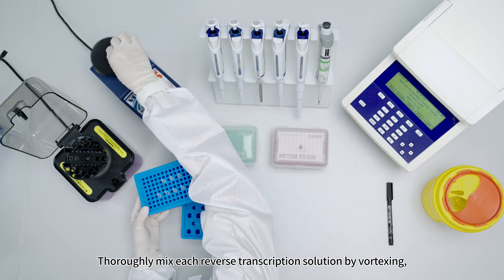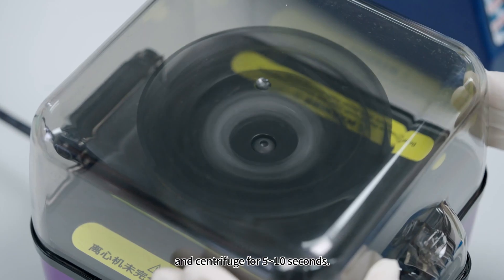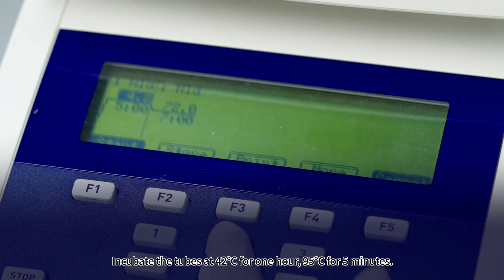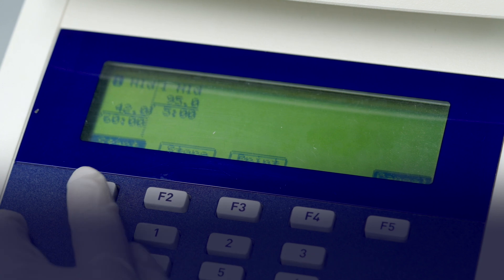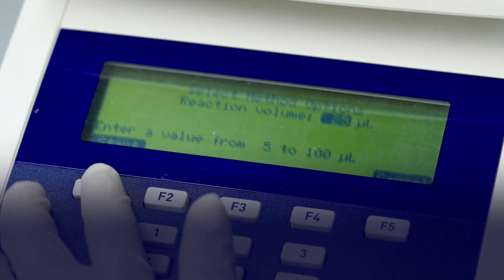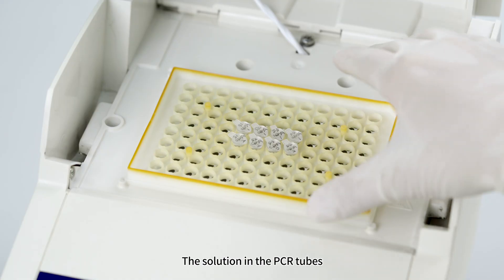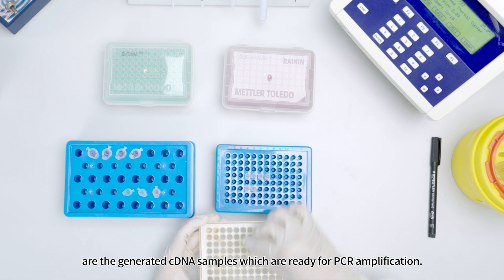Thoroughly mix each reverse transcription solution by vortexing and centrifuge for 5 to 10 seconds. Place them into the 96-well plate of the Thermal Cycler. Incubate at 42 degrees Celsius for 1 hour, then 95 degrees Celsius for 5 minutes. Set the reaction volume to 25 microliters. Transfer the PCR tubes to ice; the solutions are now cDNA samples ready for PCR amplification.